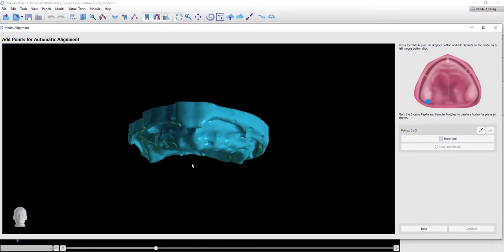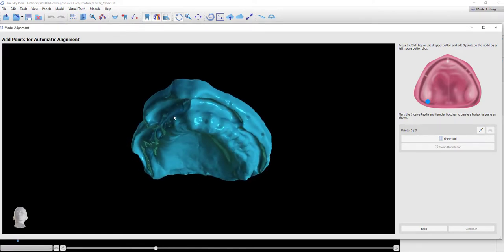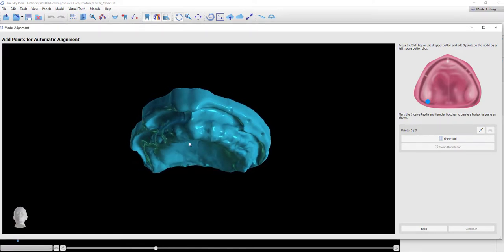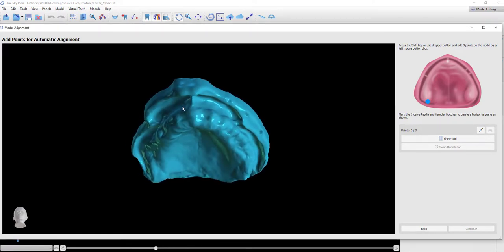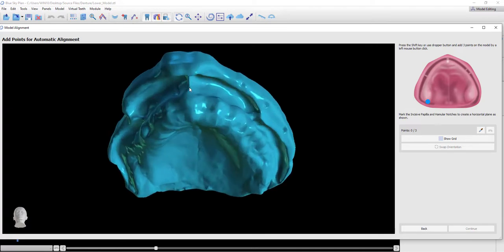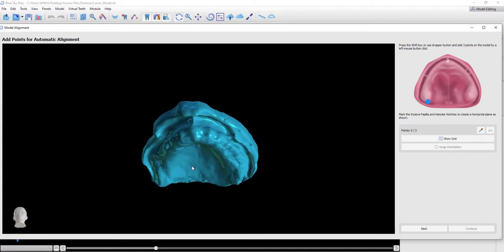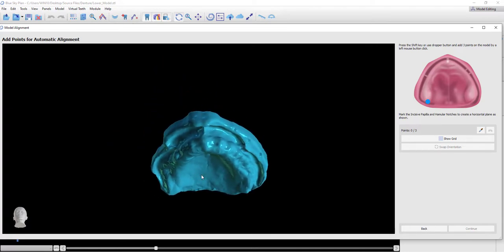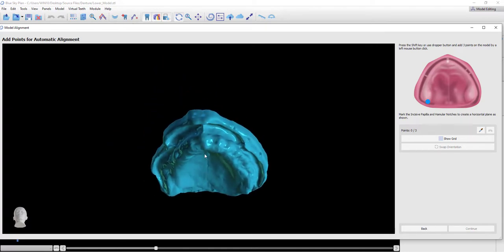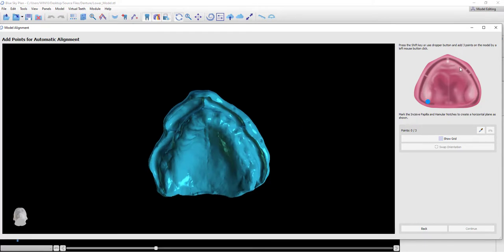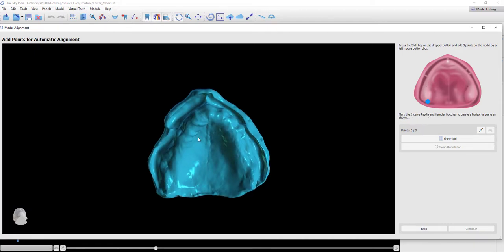On the left side of the screen, we have our normal mouse functionality: the left mouse button to rotate, the right mouse button to zoom in and out, and holding down the wheel grabs and moves. The instructions on the right-hand side display to us an image of where the dots should be marked as well as textual instructions. We are going to mark the incisive papilla and hamular notches to create a horizontal plane.